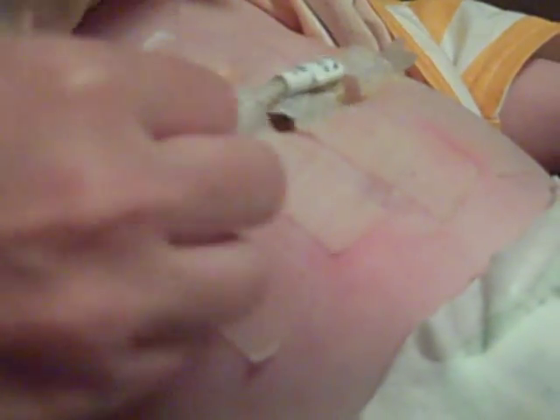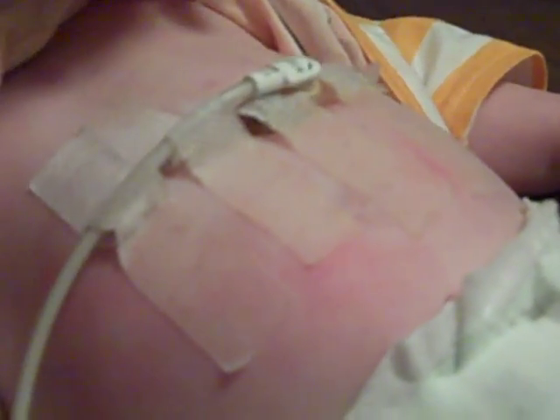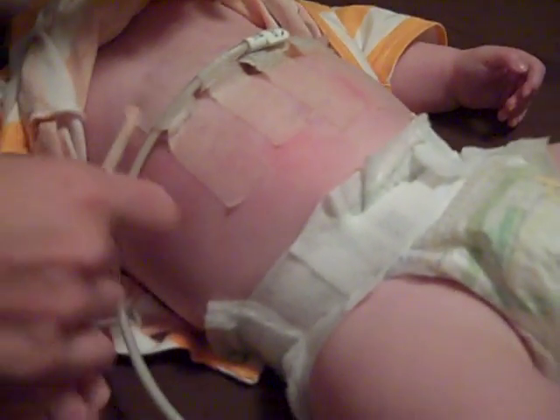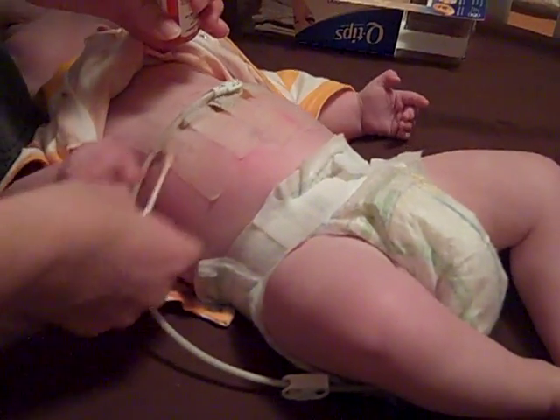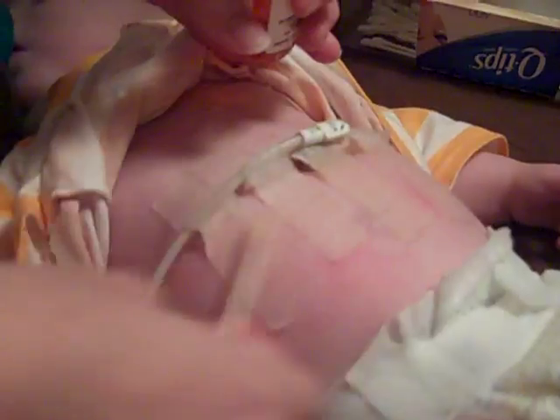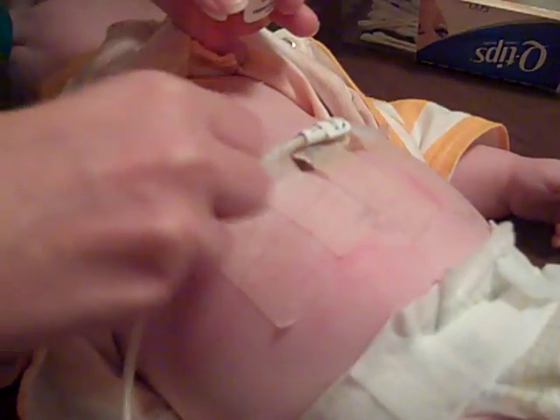I change out this dressing on this once a day and clean around the actual button, because the more time he spends on his belly, and sometimes if the balloon inside the button actually gets deflated, then he actually has leakage, which if we leave that on his skin, it can burn it. So anyway, we'll leave this on here for just a minute.